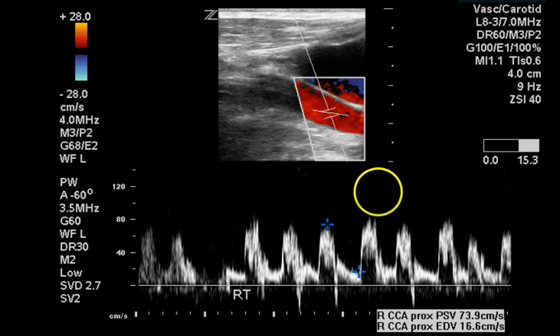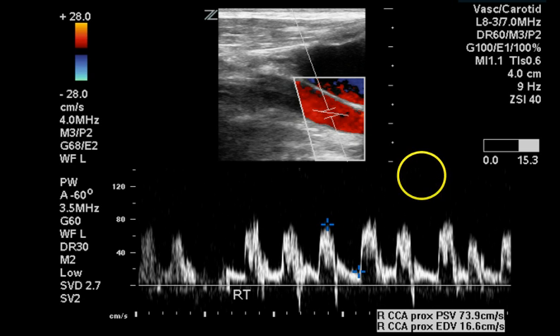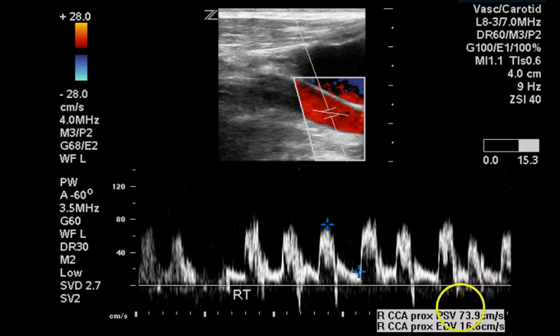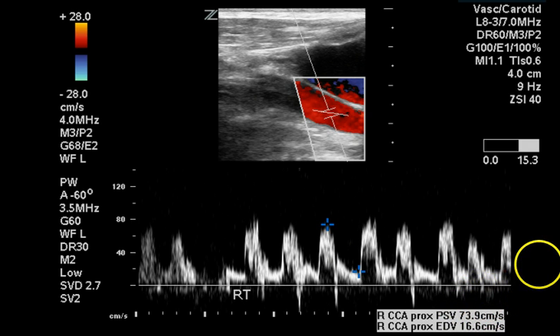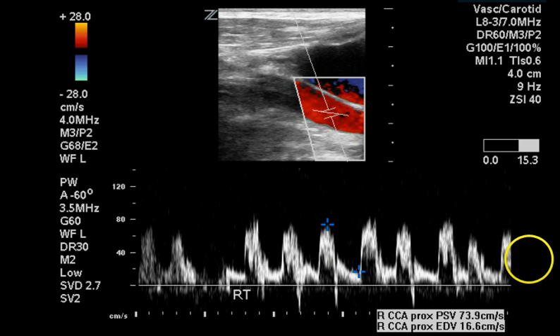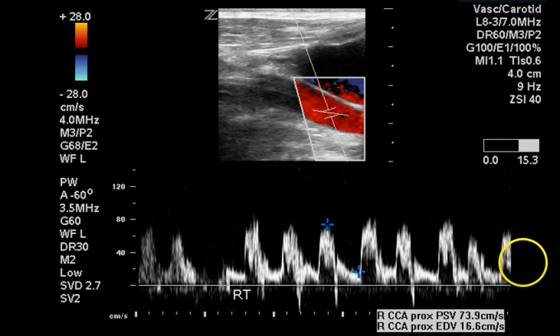60 degrees is the number that is being used. If this angle is incorrect, the velocity would be lower — perhaps 60 centimeters per second instead of 74 centimeters per second during peak systole.